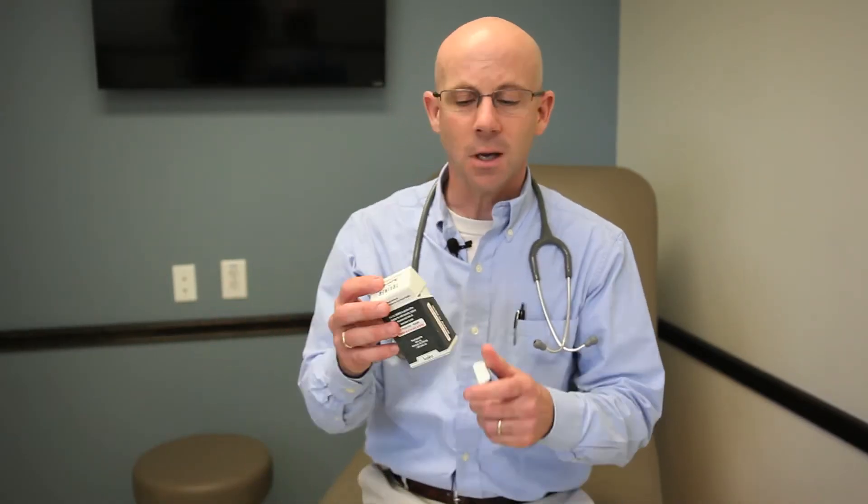This is otherwise known as the talking EpiPen. It's going to come in a box that looks sort of like this — it's going to be a different color — and you're going to have it in the case. You're going to open it up and it's going to start to talk.